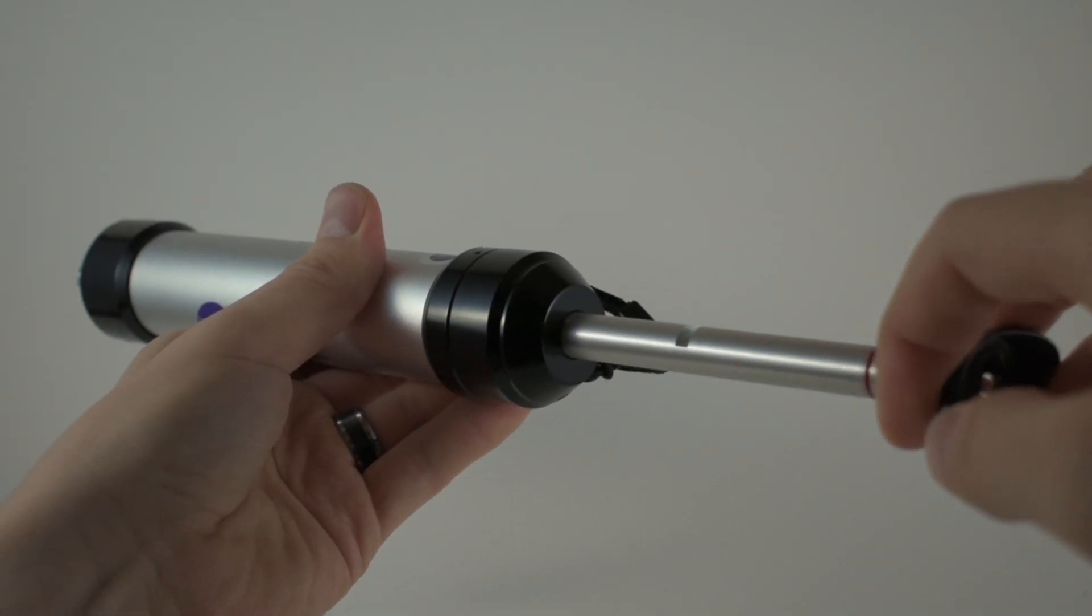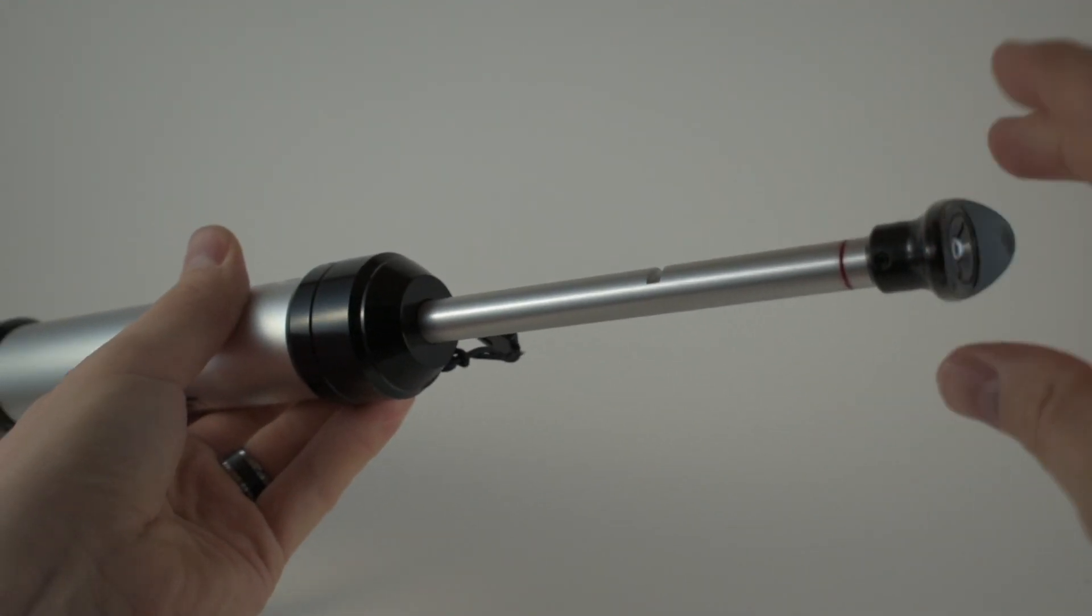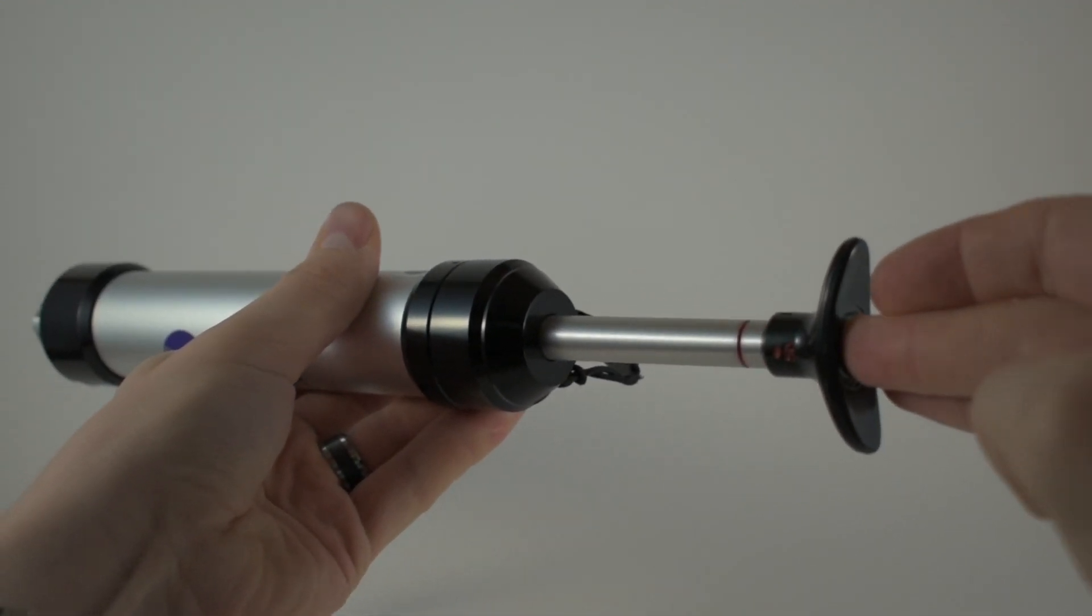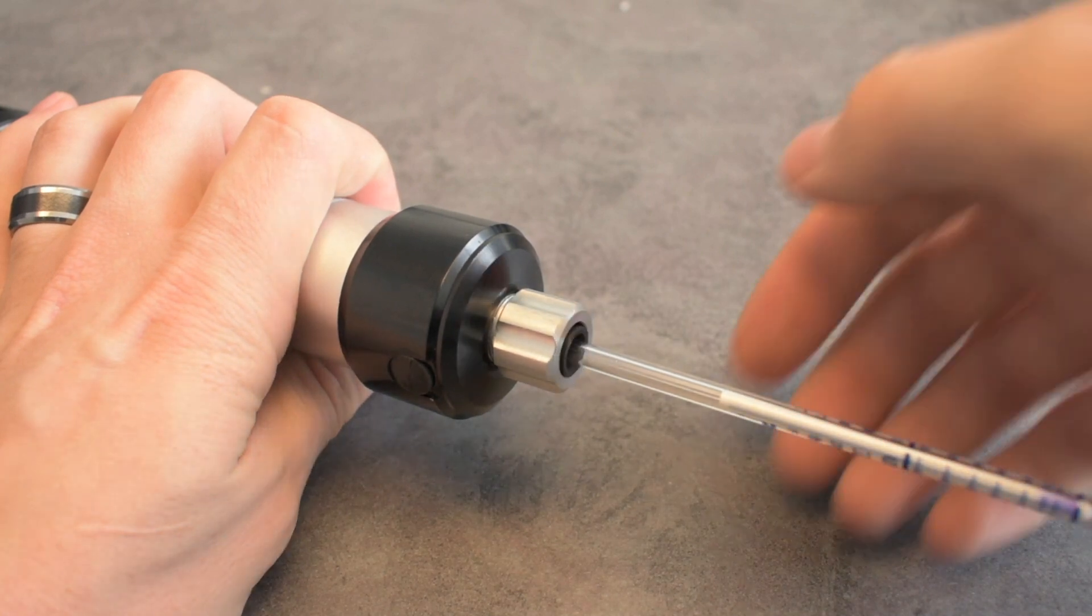For additional pump strokes, rotate the handle quarter turn left or right and push it back fully without removing the tube from the pump. Repeat the draw cycle.